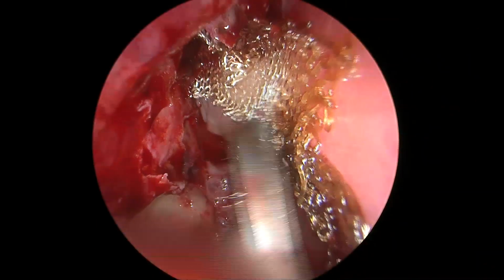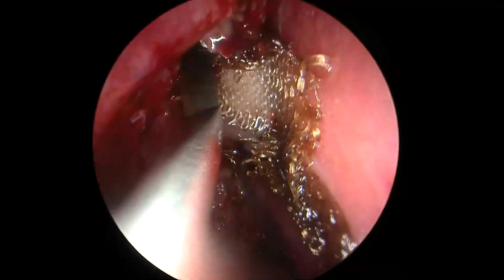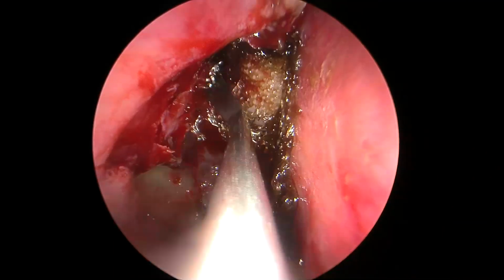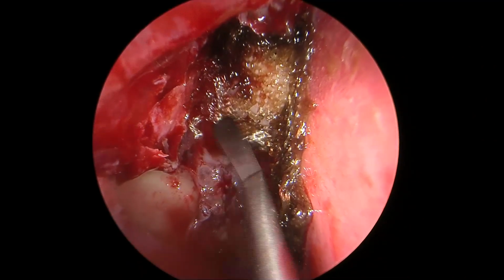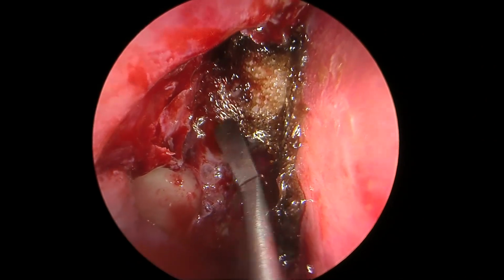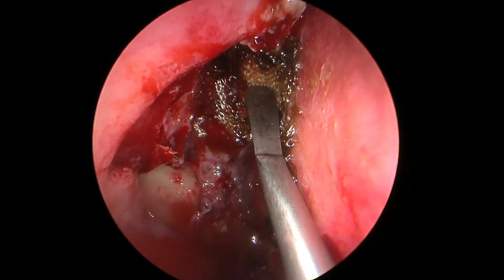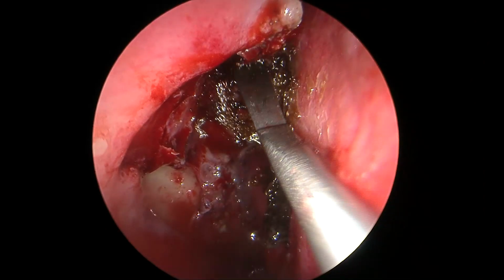And what we have normally seen is that when we use a free mucosal graft over anything, be it fascia or fat, it helps in reepithelialization of the entire surgical site much faster as compared to when we use only fascia. Only fat, of course, is not to be used because that will be reabsorbed. The fat must never be exposed to the outside environment and air.